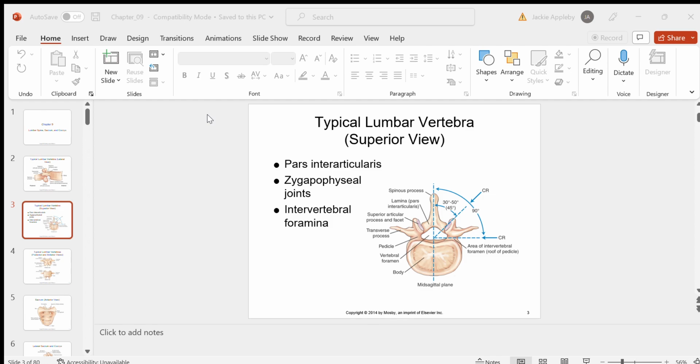What I was actually trying to get to when I was talking about this is one of our essential projections is the AP axial of the sacrum and the AP axial of the coccyx. So we'd be coming in from the front here with our central ray, and because this lays at an angle, if we came in with a perpendicular central ray, we would foreshorten our image of the coccyx and sacrum. So we want to make sure we know what angle our central ray has to be at in order to not foreshorten either of these structures. And notice that the sacrum curves that way, where the coccyx curves the opposite direction, right? So we're going to need to know two different central ray angles for the coccyx and the sacrum.